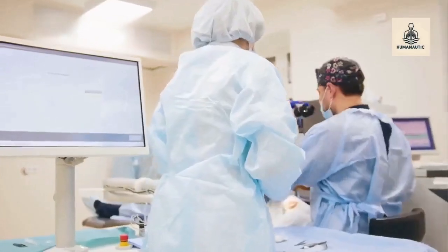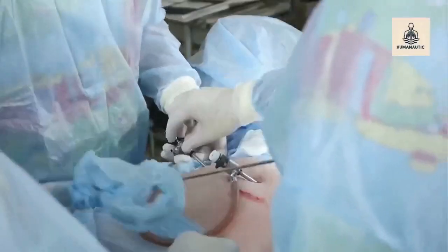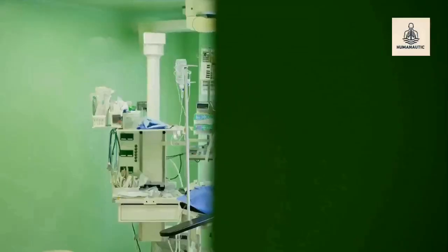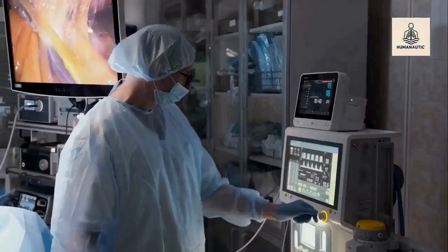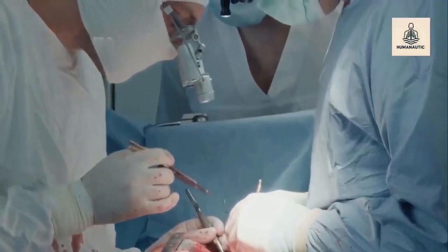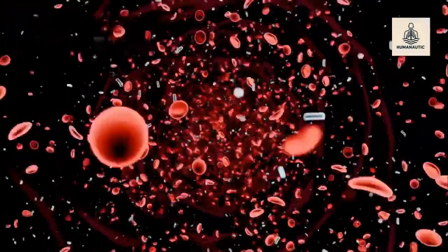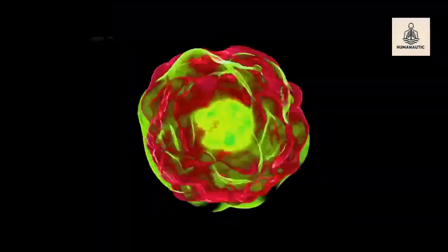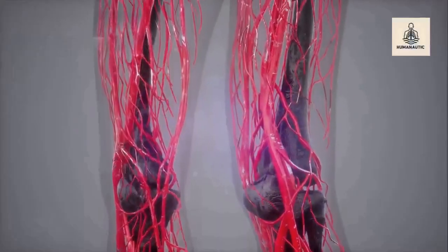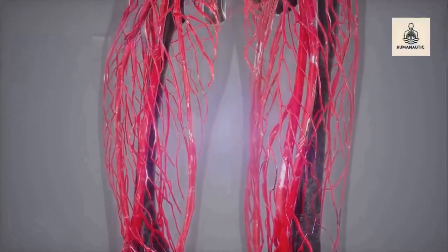Tissue handling concepts. Laparoscopic tissue handling is based on foundational surgical principles, adapted for a video-assisted environment. Essential ideas include controlled traction and counter-traction, avoiding excessive tension on delicate structures, interpreting tissue behavior visually, applying energy with awareness of nearby structures. Recognizing anatomical planes and respecting tissue limits are key learning objectives for students preparing for surgical rotations.